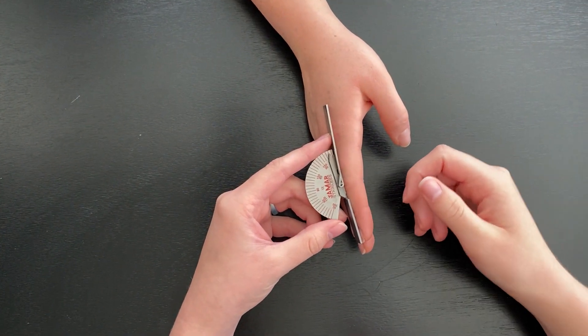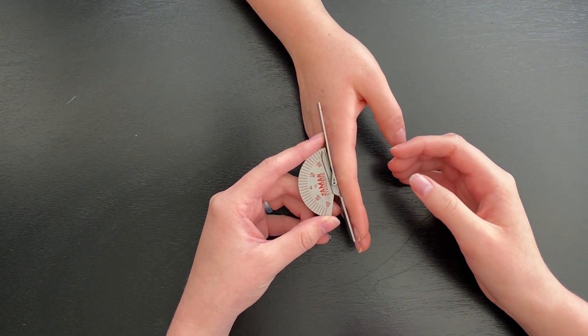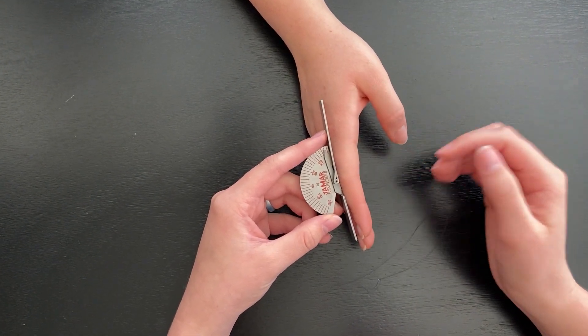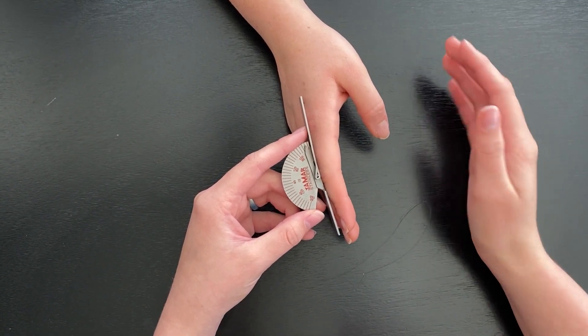We're going to look at finger PIP flexion. The typical range is 0 to 100 degrees. The patient will be seated at a table with their upper extremity on a flat surface and their ulnar side down.